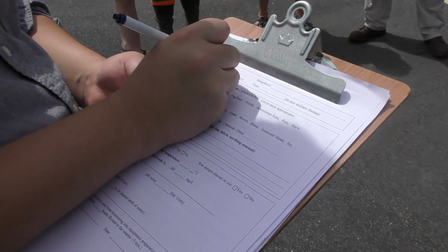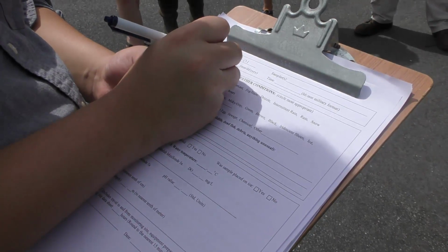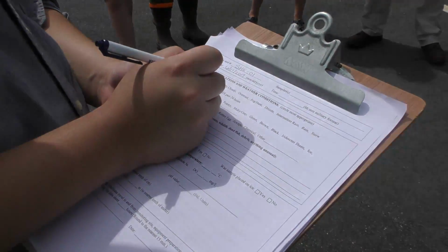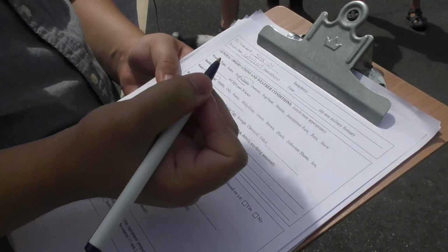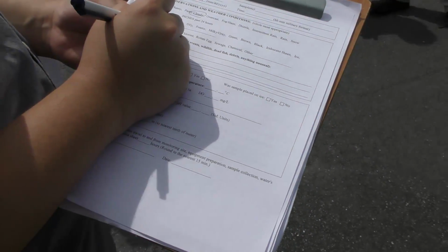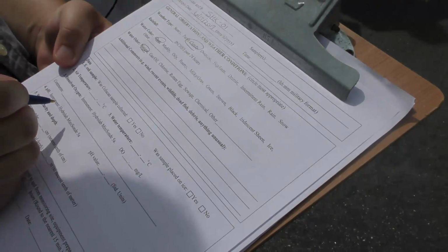When you get out into the field, it's a good idea to fill in a field sheet. The field sheet includes important information such as the station number, which is used by the laboratory to know which sample is associated with each field sheet. In addition, the field sheet provides useful information such as current weather conditions, recent rainfall, which is important for E. coli measurements, and any other field readings that are collected while on the site.